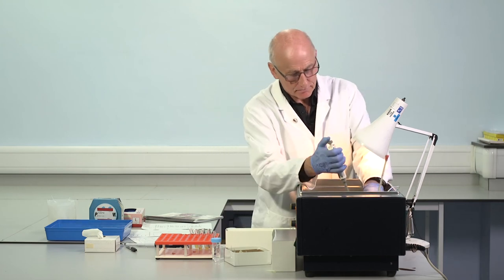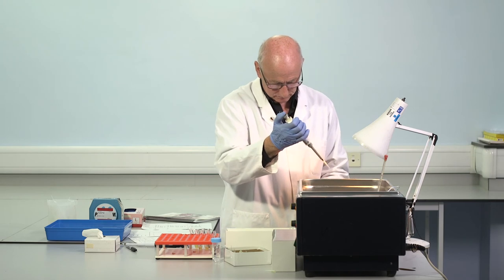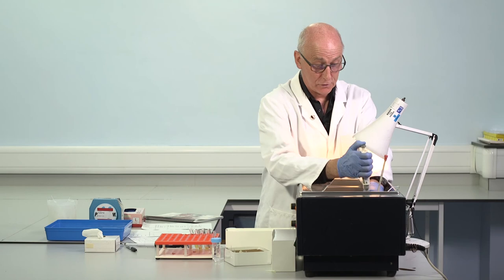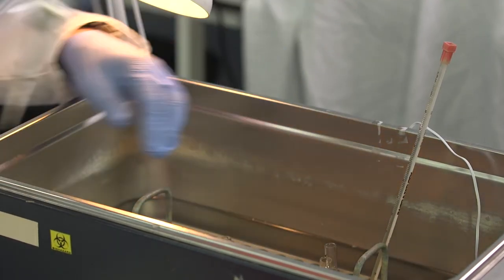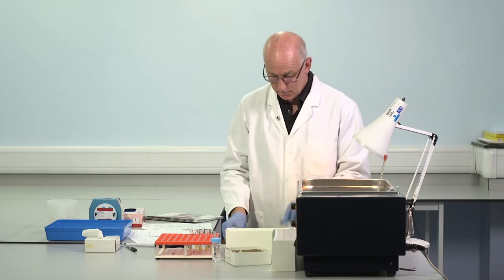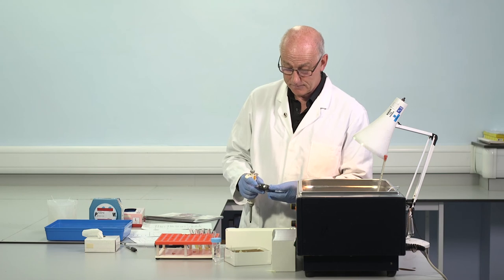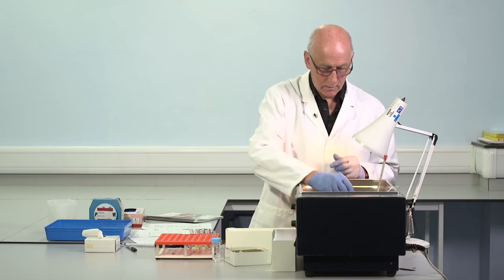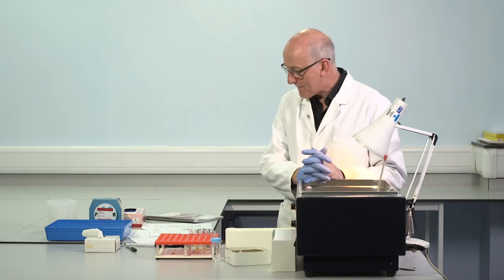Okay. APTT reagent, this is the control. This one also has a 3-minute activation time. Okay.